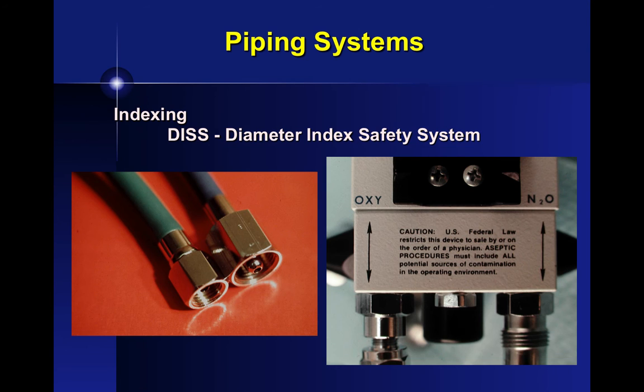This machine had a leak in it. It was sent back to the manufacturer to have it repaired. The manufacturer, in the process of rebuilding it, set these up backwards. And so in the clinic, in the dental school, they had a machine that was set backwards. One of the graduate students was using nitrous with his patients for some surgery, had a woman who didn't seem to want to wake up when he put her on 100% oxygen. It went on for a couple of minutes, and he had heard my discussion of what could happen, and that in that situation, if a patient goes to sleep, take the mask off, which he did, and the patient was back within a couple of very short minutes. It seemed like an eternity for him waiting, however.